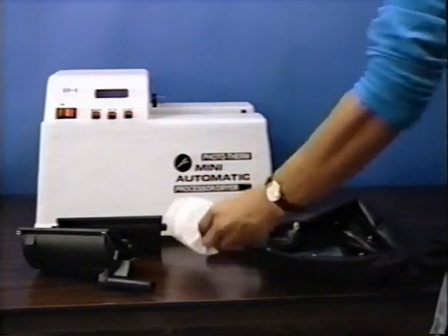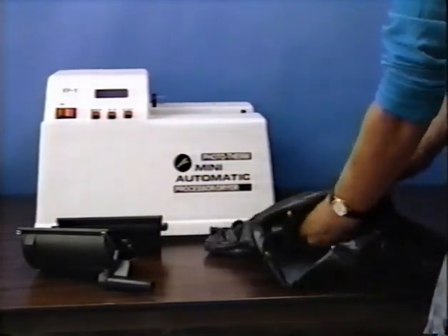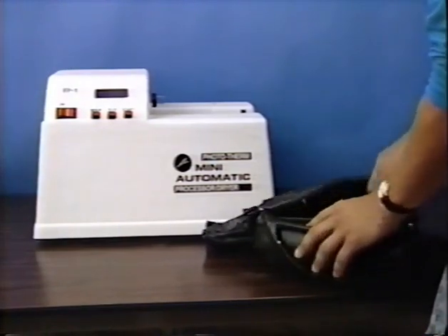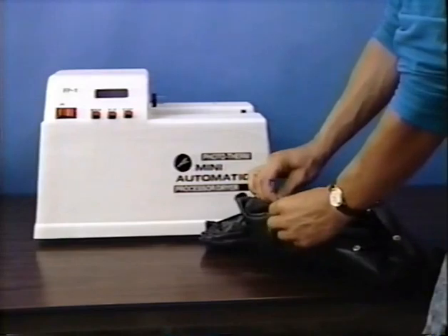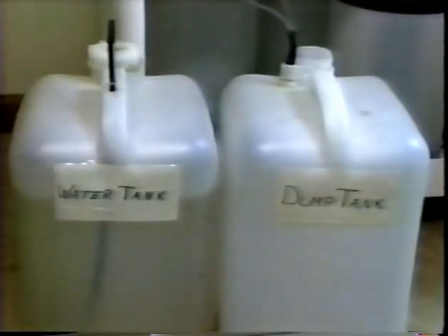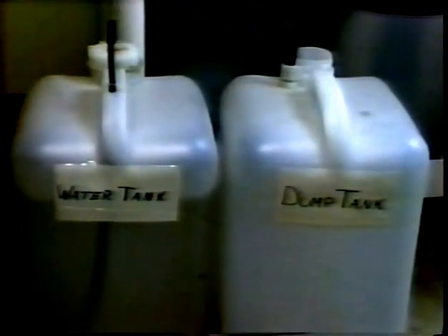The FP1 Mini Automatic film processor dryer is a compact unit which can be set up anywhere. A darkroom is not required since loading of the film onto the film reels can be accomplished using a dark box or inexpensive film changing bag available from any camera store. Plumbing and tempered water valves are also not needed since the unit comes with two large five-gallon containers to hold the rinse water and the used chemicals after processing.